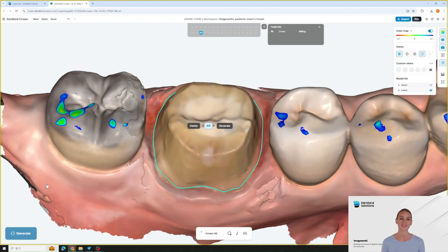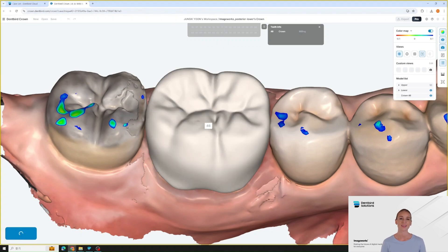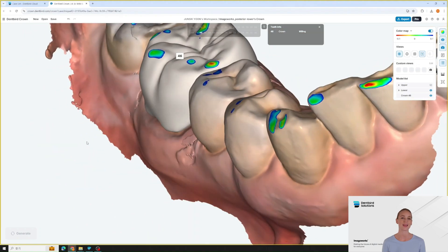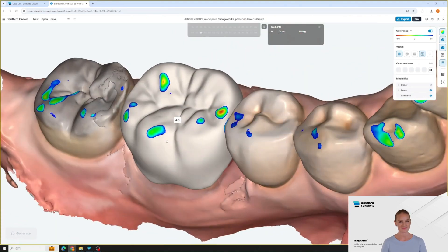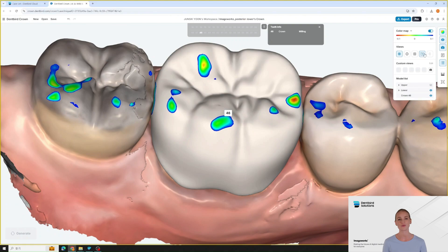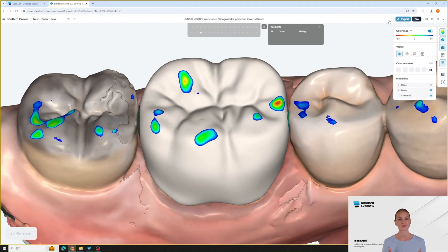Now just click generate to create the crown. DentBird AI automatically designs the crown, perfectly adapting it to the patient's anatomy. The margin is precisely detected and AI proposes an optimal crown. As you can see, the design is in good quality — the contact is ideally formed and the bite is also shaped ideally. It's easier to observe if you turn the tooth label off. Just click export and your design is ready.